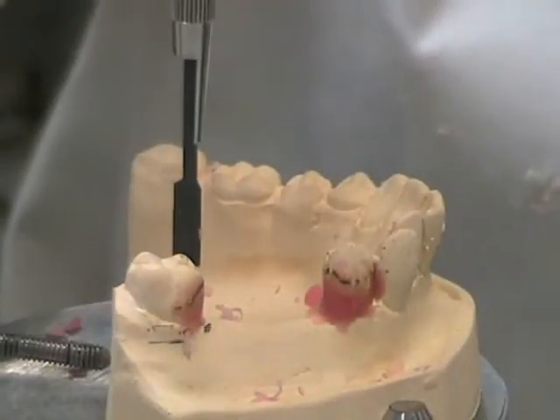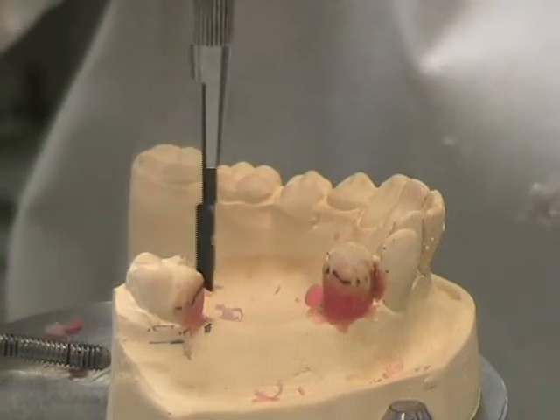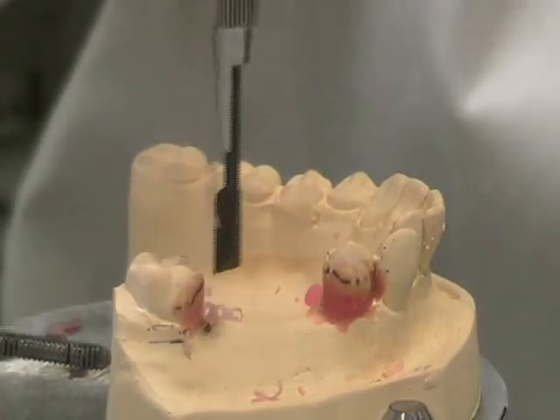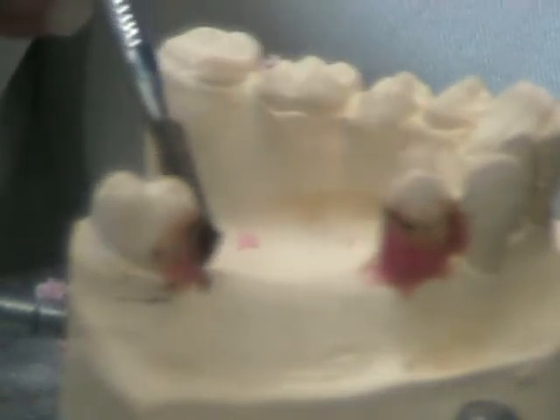Once complete, these parallel surfaces will aid the denture to seat into position. We can see that those two surfaces are indeed parallel.